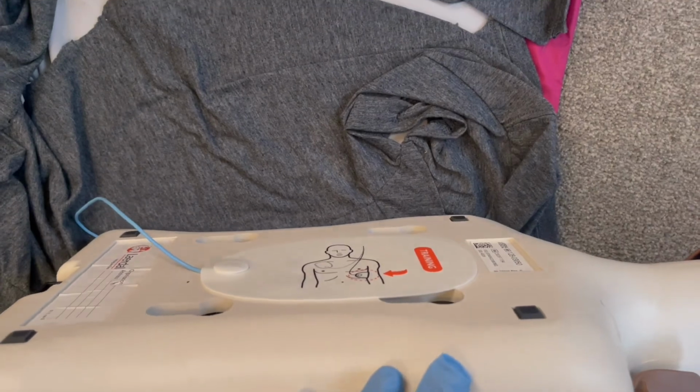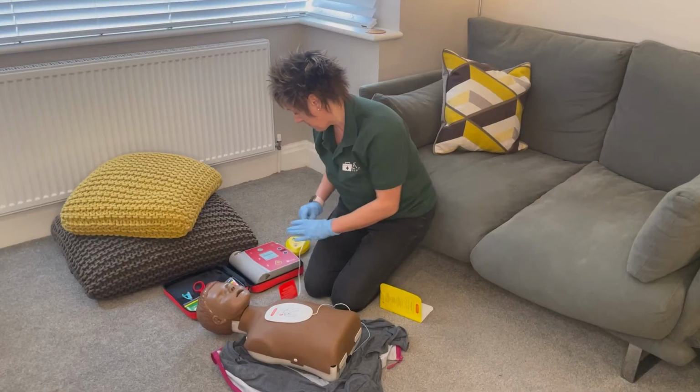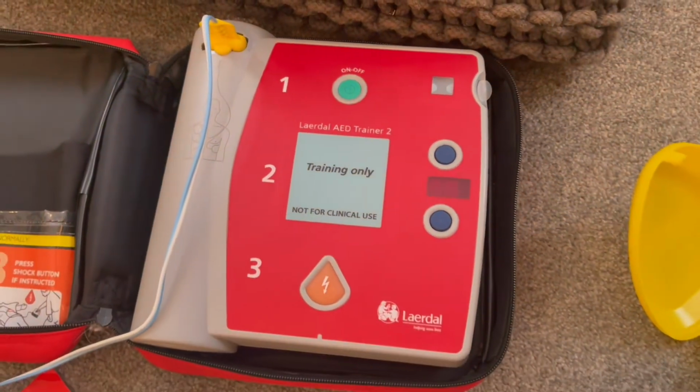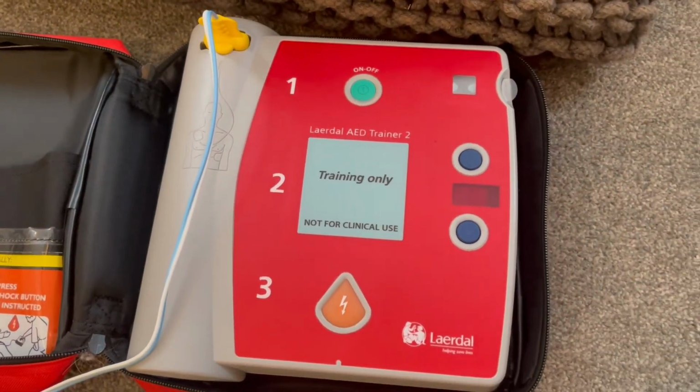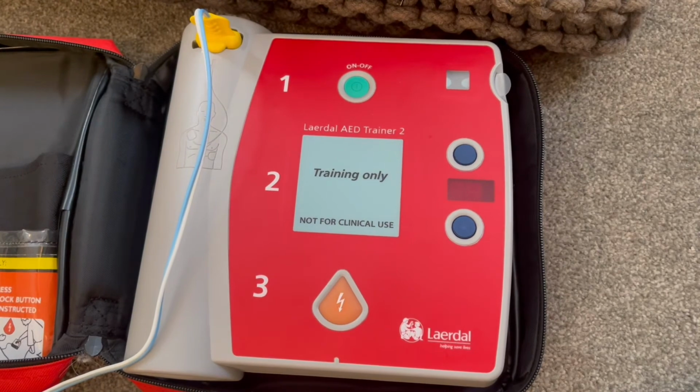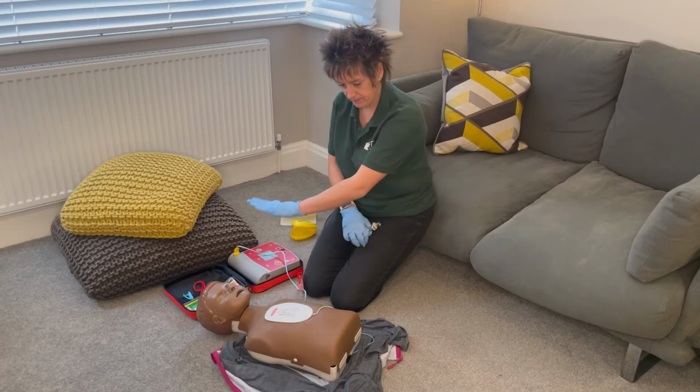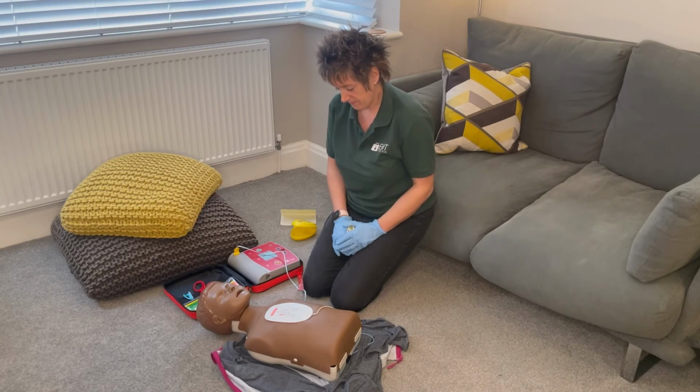When the pads are in place, we're going to plug it in and listen to the instructions. Analyzing heart rhythm. Do not touch the patient. So it's looking for a shockable rhythm. So we're making sure we're not touching the casualty as it's doing that.